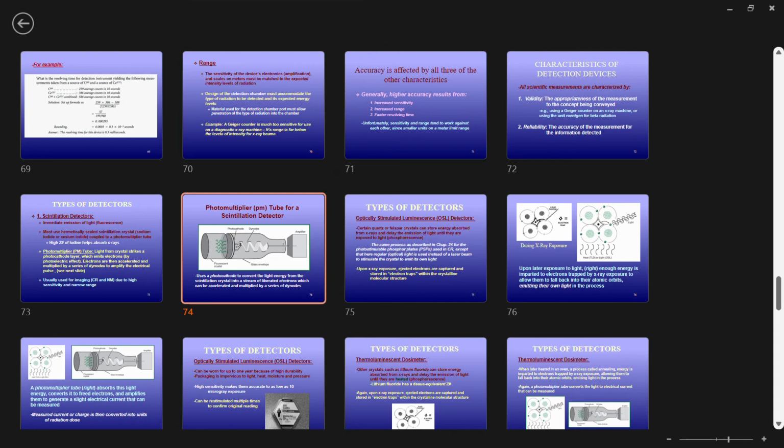So this scintillation detector is not in the X-ray tube? No. This is a measurement device that's used by inspectors, radiation physicists, people who come and calibrate equipment. They're going to use this to make measurements. Your X-ray tubes can't make any measurements. Your X-ray tubes just make X-rays, based on the settings that you create. The only way to take a measurement is to bring a device in like this, set it on the table, make an exposure, and measure the intensity. That's one type, used by inspectors, used by physicists, used by anyone who wants to measure the intensity and energy of the radiation from your X-ray tube at different points.